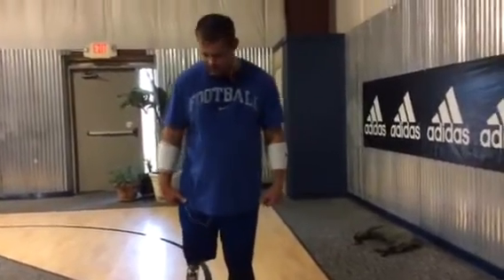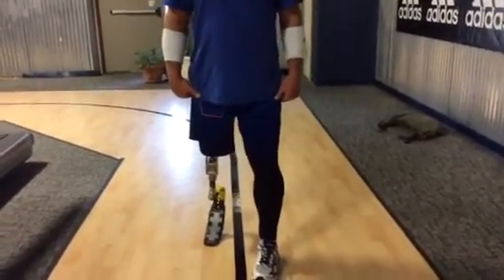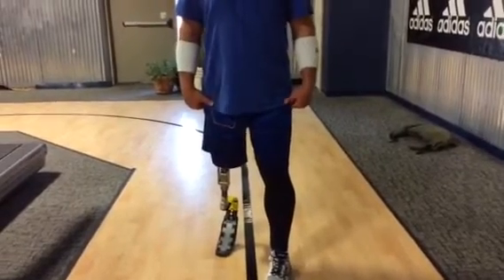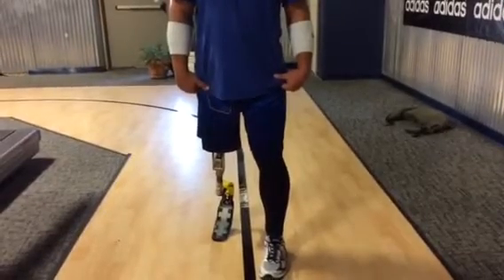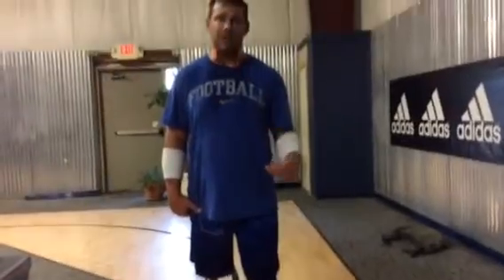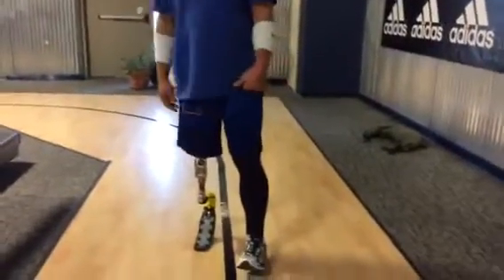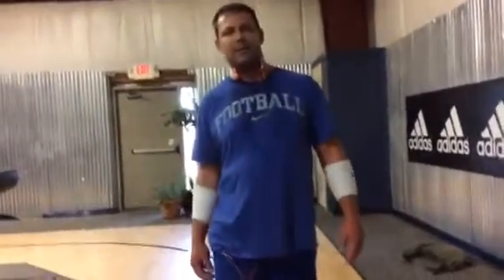When you do that, you really have to load your toe and get all of your weight. You have to learn to trust that prosthetic so much. And it's going to be hard at first. And you're going to look completely ridiculous. You're not going to have any real form when you start out, but you just have to keep going. And as you get better and better, you start to get more form. But you really have to load that toe and allow all that weight to come down on that blade in order for the knee to break and come through.